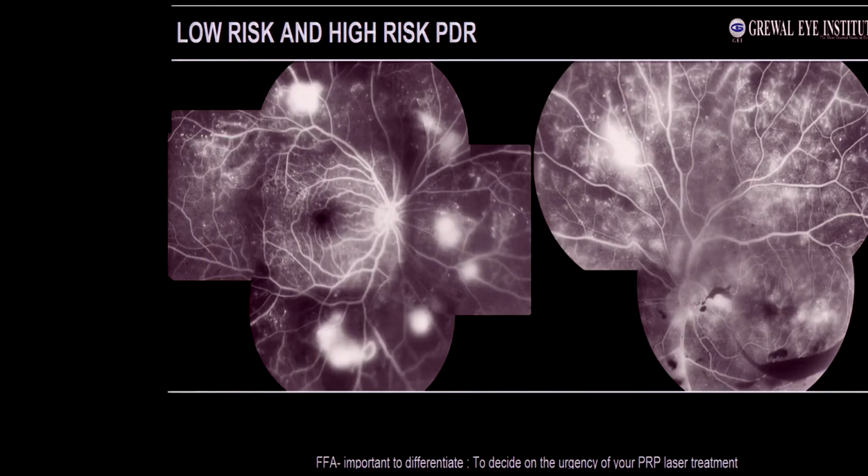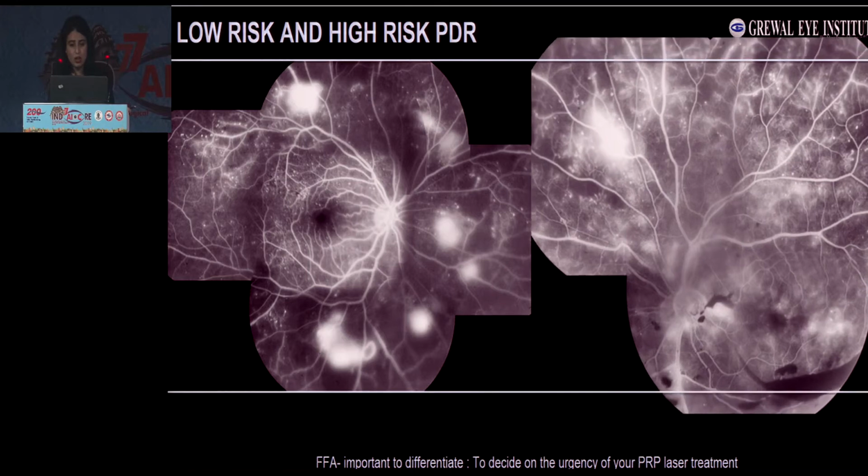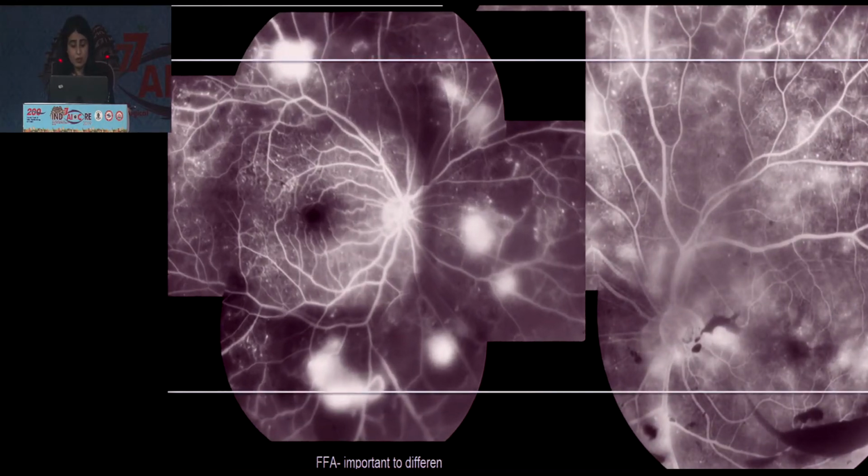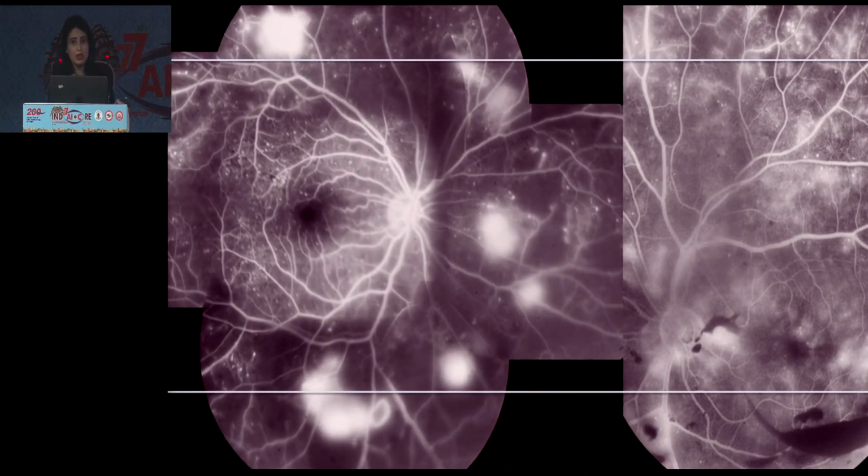This classifies it as a high-risk PDR, and it needs an urgent attention, whereas the picture on the other side is of a low-risk PDR, where you can still wait, you can't really wait, but there's no urgency to start it on day one itself.